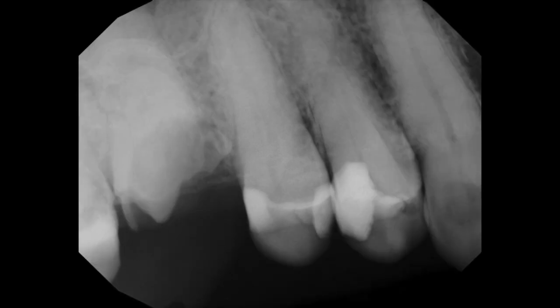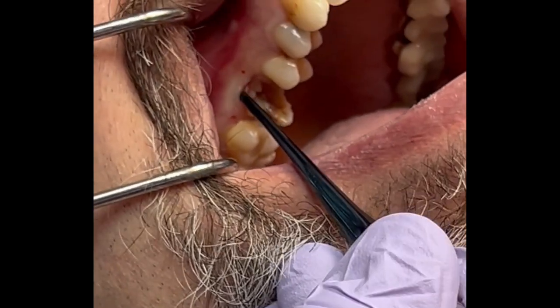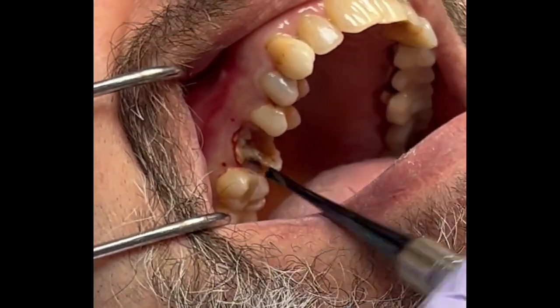Teeth often present to our practices that need to be removed — they're deemed non-restorable. So we anesthetize the area and we want to remove the tooth.